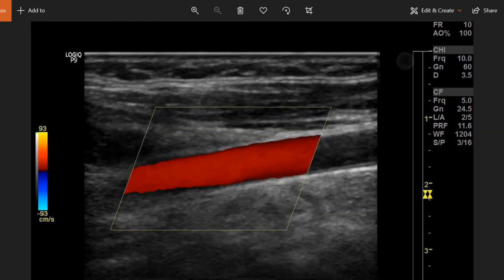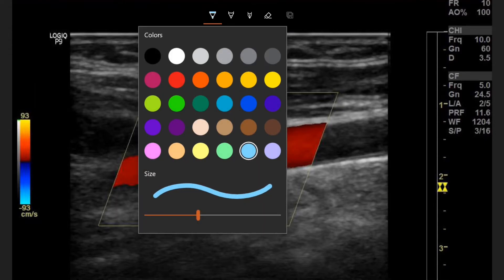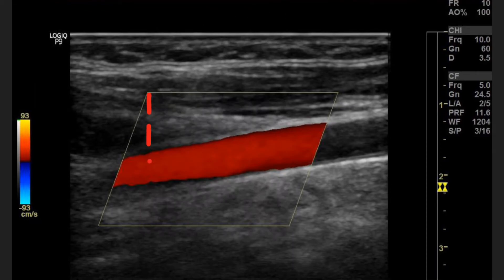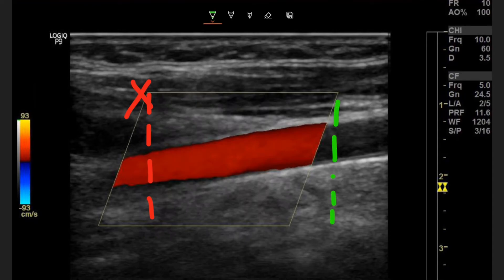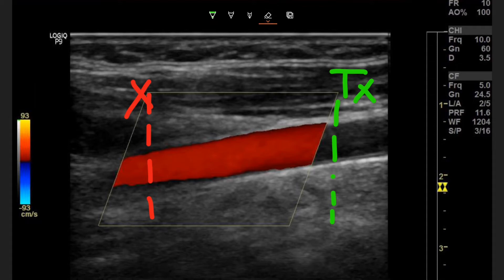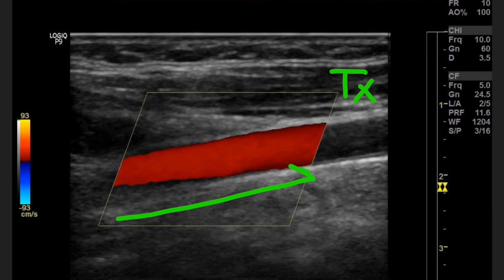Now our box is steered the other way, so we need to figure out where our transducer location is. I'm going to draw that imaginary line from the top of the color box — the line on the left is inside of the color box, so this is not our transducer location. I'm going to draw another imaginary line from the top of the color box all the way down; this line is outside of our color box, so our transducer location is over here on the right. Looking at our color map, red is on top and blue is on the bottom. We have red in our vessel, so red is coming towards the transducer — the directional flow in this vessel is from left to right.